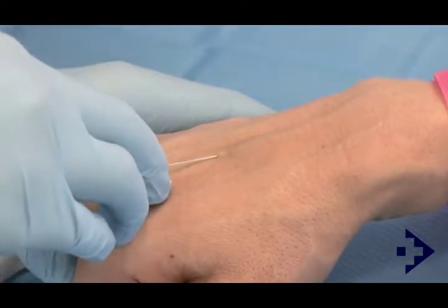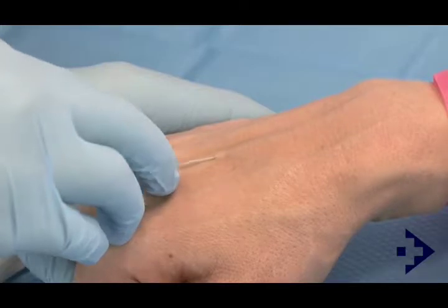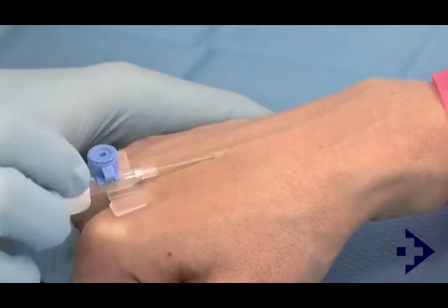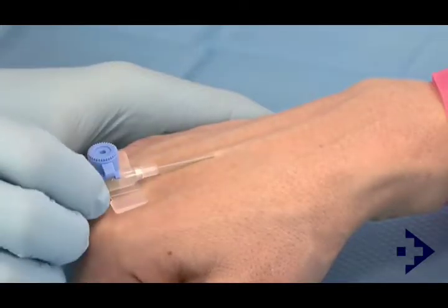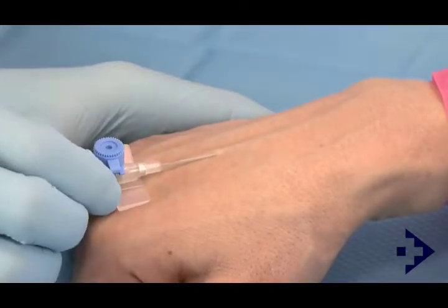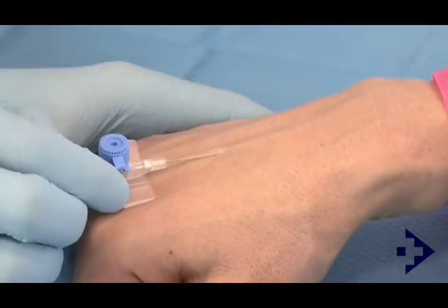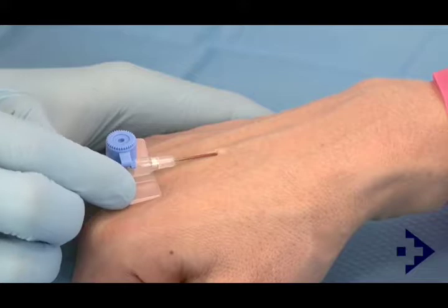The needle is slowly passed through the skin until there is a give as the needle tip enters the lumen of the vein.